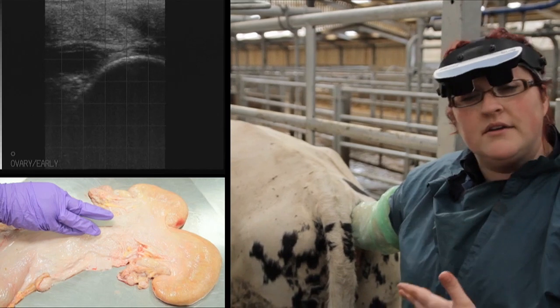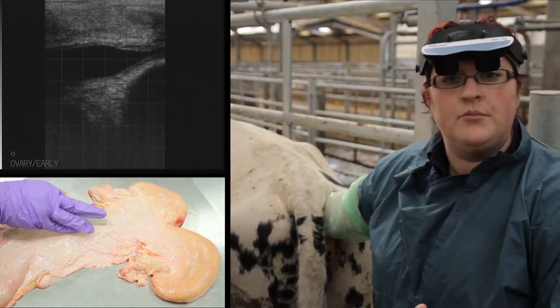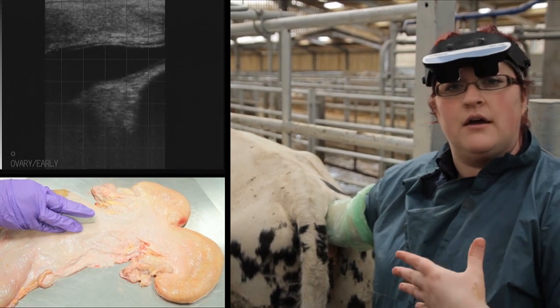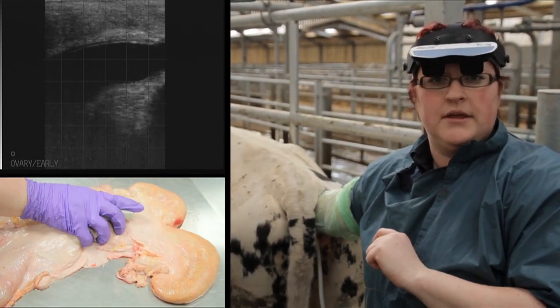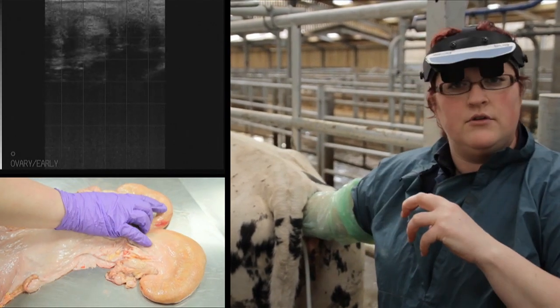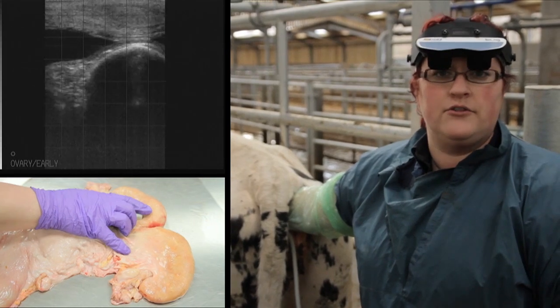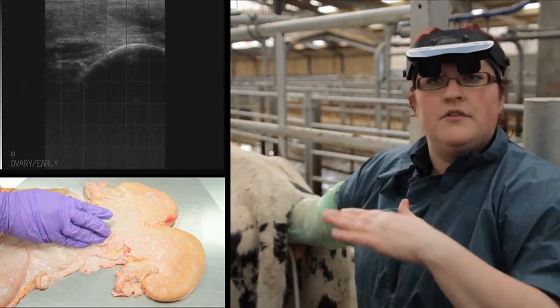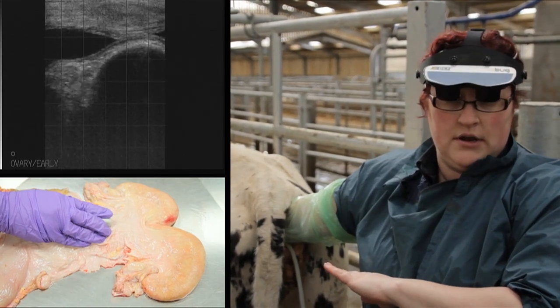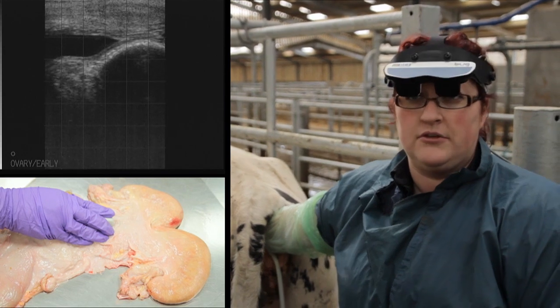If it's a multiparous cow, and we're wanting to evaluate the ovaries, for example, we may need to actually grasp the cervix or the intercornual ligament and retract the uterus back into the pelvic canal so that we can evaluate all of the structures that we need to. In this cow, the uterus is located very nicely within the pelvic canal, so I won't need to do that in this particular cow.